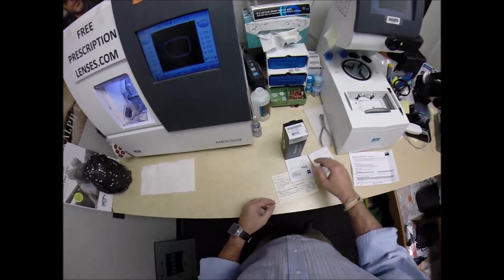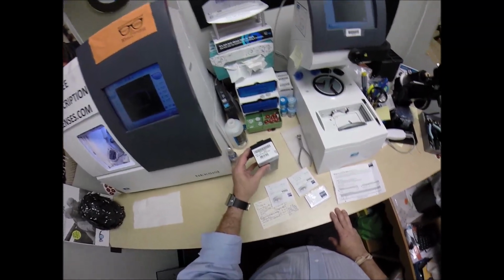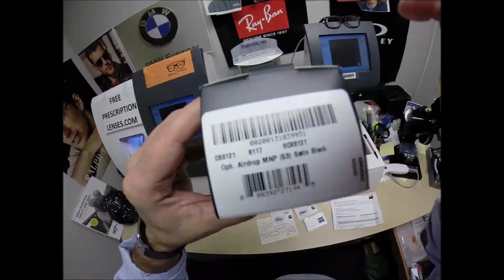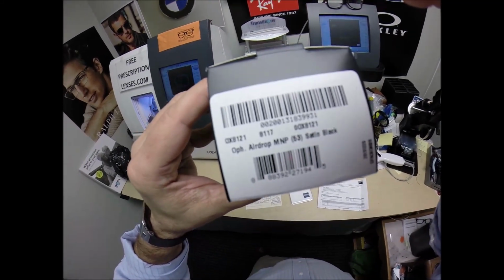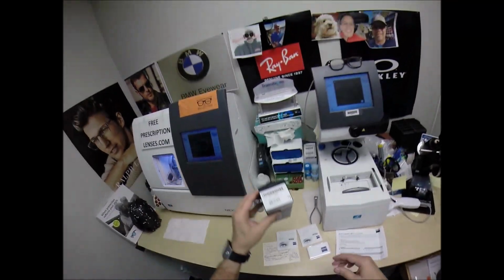When I cut the Zeiss Light D PhotoFusion Extra Gray with DuraVision Platinum for your Oakley, this is the, hang on, let me see if I can get that in focus, the 8121, which is the AirDrop MNP, not the regular AirDrop 8046, the 8121, size 53, color 01, the satin black.